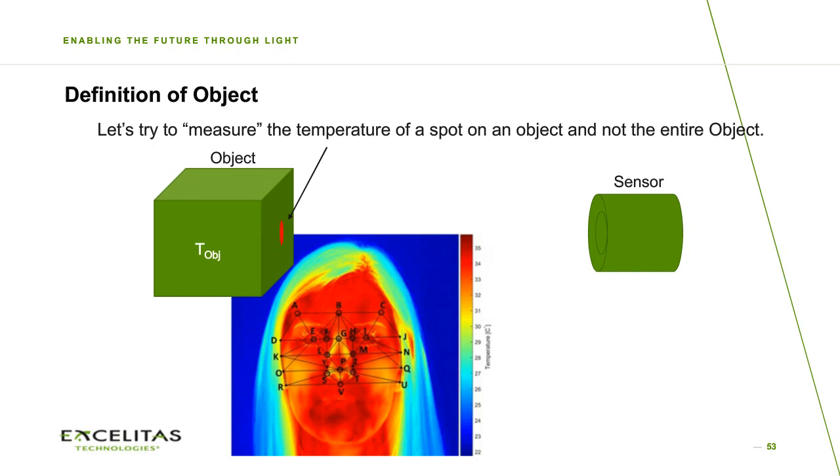So yeah, maybe I didn't answer yet the question. Maybe just a general comment, I don't believe that it makes sense to measure above 50 centimeters to have an accurate measurement. And the accuracy will still not achieve medical grade accuracy.